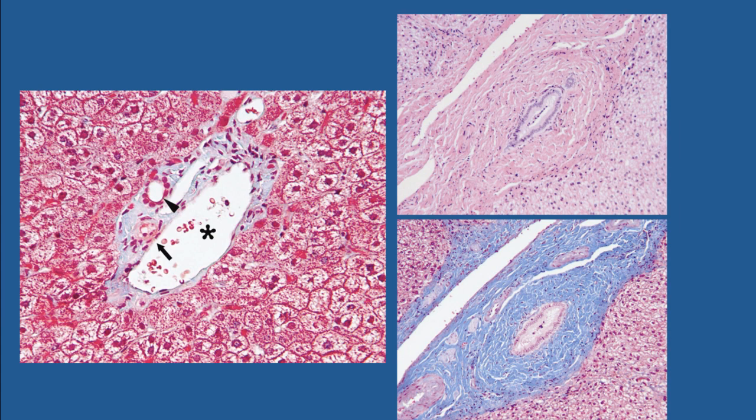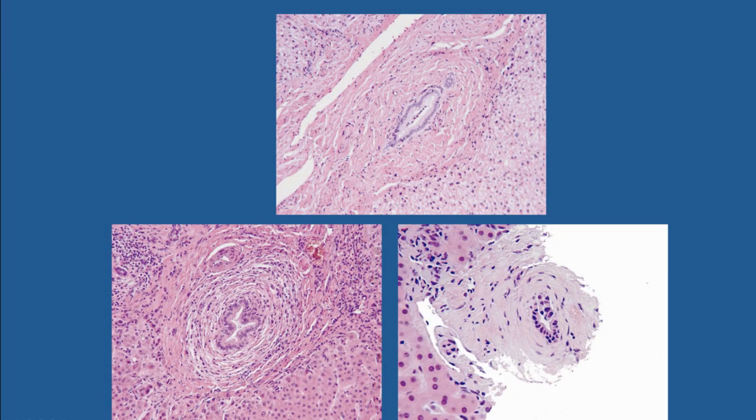So how do we differentiate between primary sclerosing cholangitis and what is normal? This is a normal large bile duct with the fibrous tissue that it's entitled to. Whereas this is primary sclerosing cholangitis in its active stage. And you see that there is a concentric type of fibrosis and concentric inflammatory infiltrate around the bile duct. Now, you might say that it's all very well if you have the inflammation around the bile duct.